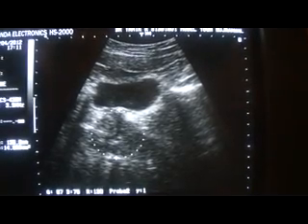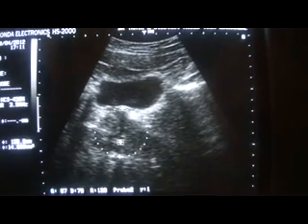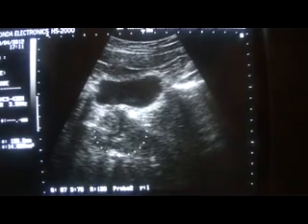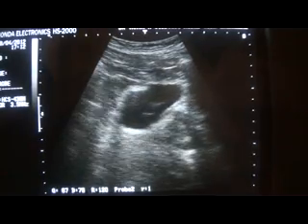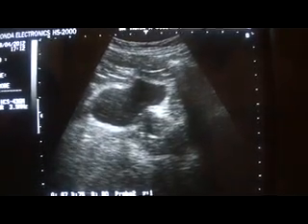This is the longitudinal section of the prostate gland. The size of the prostate is normal. The calculated measurements show that the prostate measures approximately 25 grams, and up to 40 grams is considered to be normal.